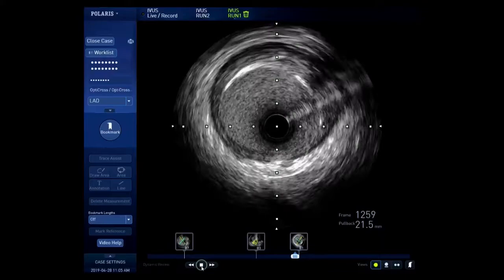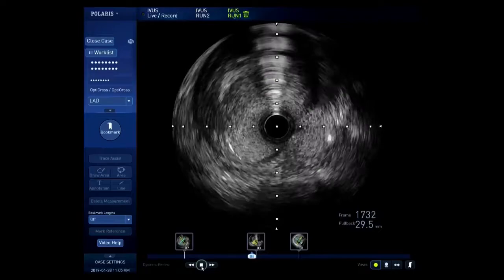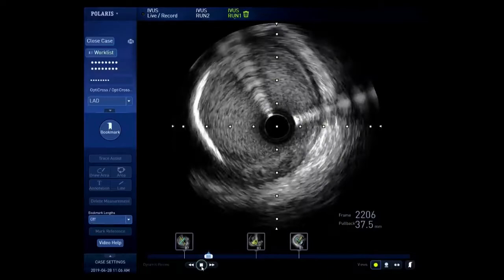So this is the LAD, correct? Craig, we're already at 4 millimeters. 1, 2, 3, 4, 5. Almost 5 millimeters. Yes. Now we're getting to the diffuse disease in the LAD. Correct. 1, 2, 3, 4, almost 6 millimeters. Very tight. And now we're in the left main. And here's the plaque rupture. Right. And the left main is 7 millimeters. So to me, this is a very simple single stent case. I wire the intermediate, I wire the circumflex, wire the LAD, one stent crossover.